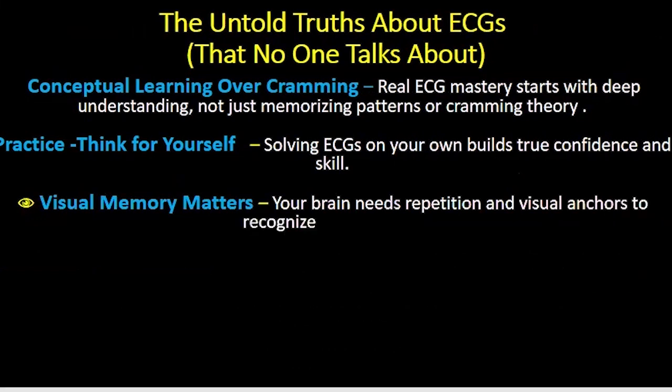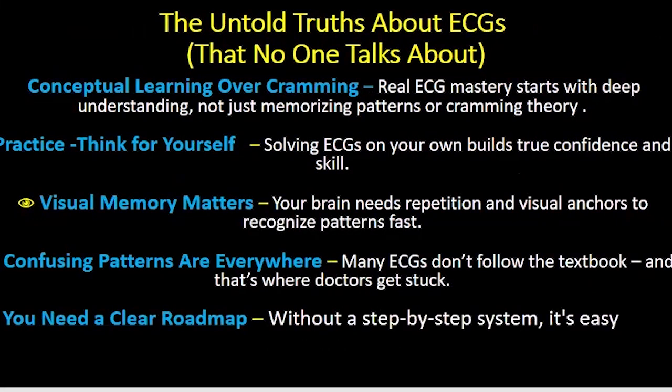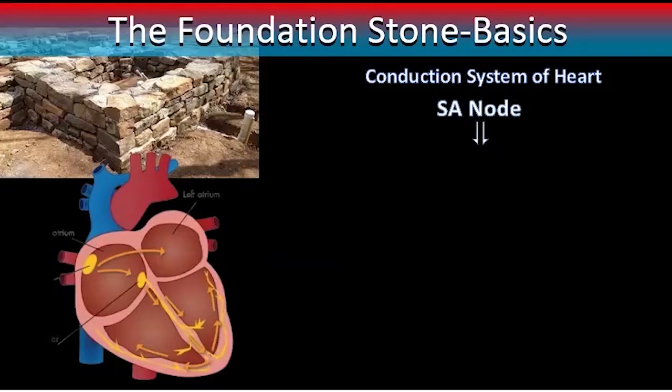I'll break it down for you in just a couple of minutes and show you what really works when it comes to mastering ECG interpretation. In this presentation, we will discuss these untold truths about ECG in a step-by-step systematic manner. For conceptual learning, first you should have a strong foundation. This includes the basics of ECG.